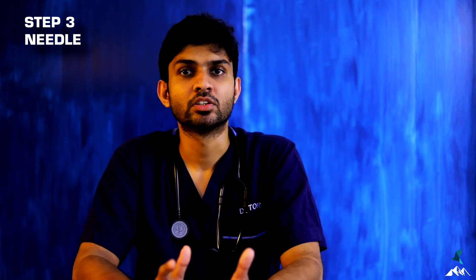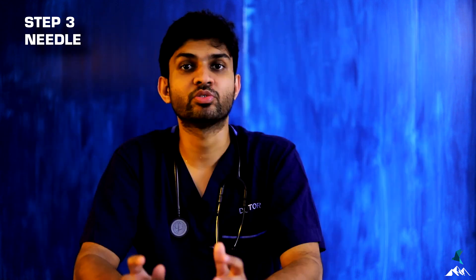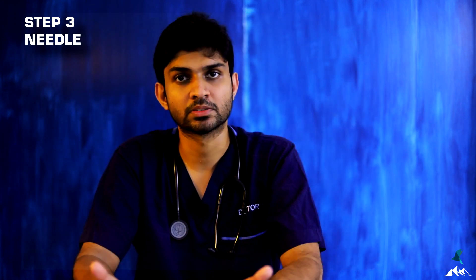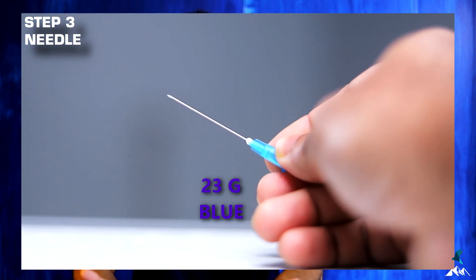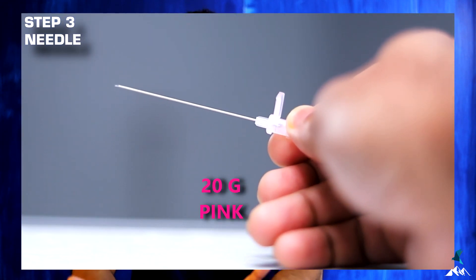Step three: which needle to select. People use 20, 23, or 26 gauge needles — there is no hard and fast rule. Even a 26 gauge needle can be visualized under ultrasound. The deciding factor is patient age: for pediatric patients, 26 gauge needles cause less damage and more comfort. In adults, 26 gauge can be used but requires more pressure for injection, so 23 gauge is also an option. In early phases when identifying the needle is difficult, 20 gauge can be used; as you improve skills, use smaller needles.